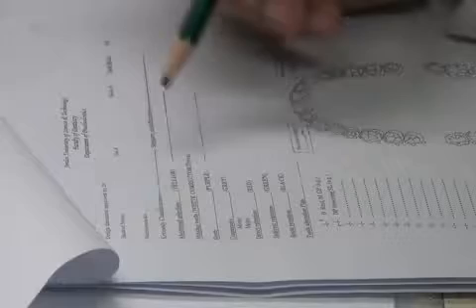Okay. For any cast you get, you should fill in the Kennedy classification as well as the support classification. Because even when the Kennedy classification is a class 3, for example, class 3 will not tell you the number of teeth missing. So if it's extended bounded saddle, the type of support is different.